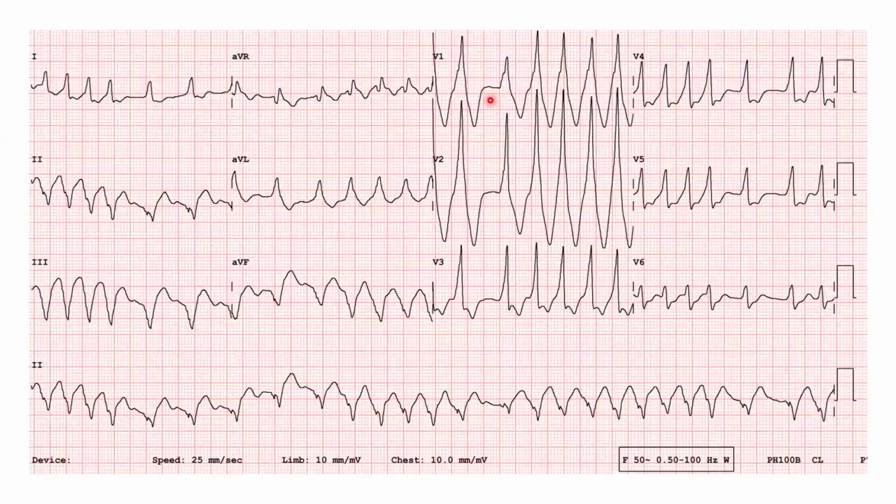So this is an ECG. You can see that it is an irregular rhythm. Is it in favor of VT? It's not in favor of VT. As you can see, it's very irregular. This amount of irregularity you can't see in VT. And you can see that the QRS is not typical of any bundle branch block. It's more in favor of a delta wave in V1 and also in 2, 3, aVF. So it's a pre-excited AF involving a left lateral accessory pathway.